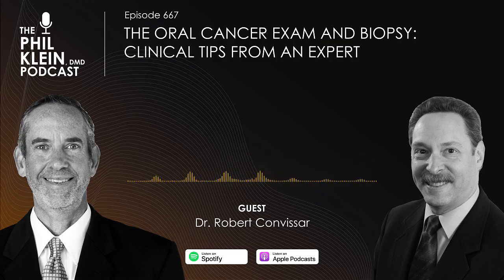It'll fluoresce differently. You'll see a tremendous difference in color. Take a picture, send the picture to the oral surgeon. This is what I saw, and take it from there. So you do a lot of biopsies when you need to.